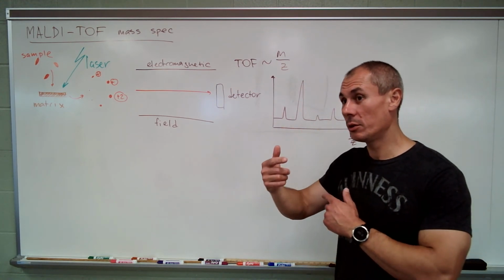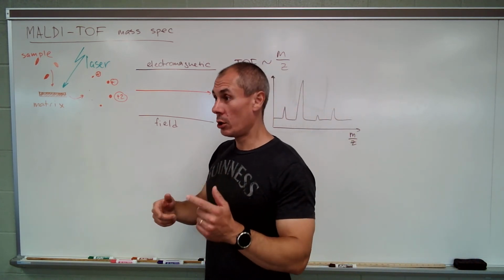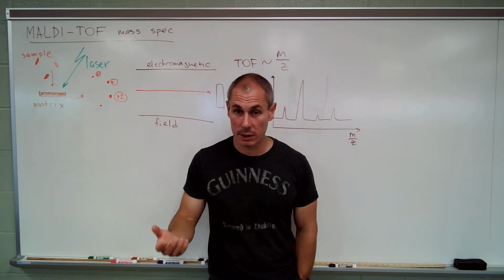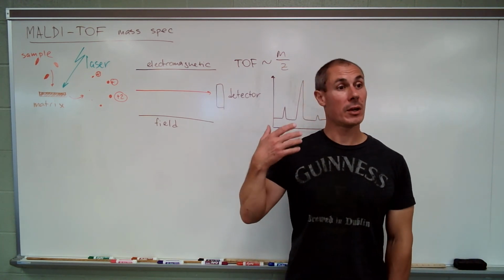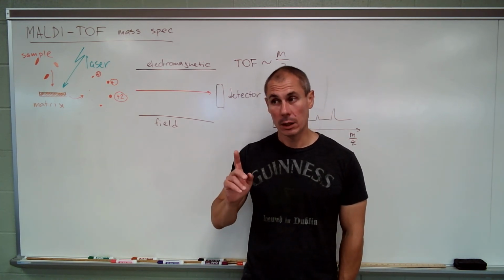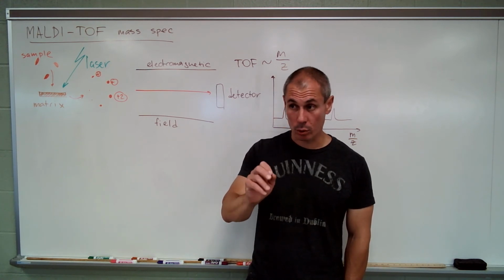So now you can do the reverse process. You accumulate an enormous database which contains mass spec signatures of many individual bacteria. Does that make sense? Then you have a patient with unknown infection. A little bit of an obstacle, you need to have it in the pure culture.